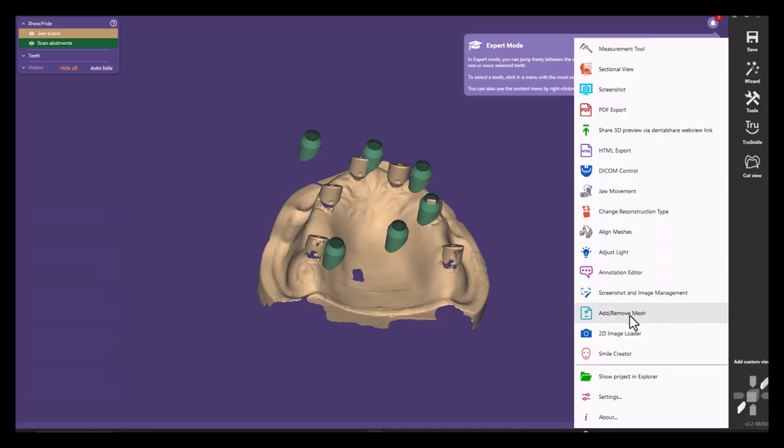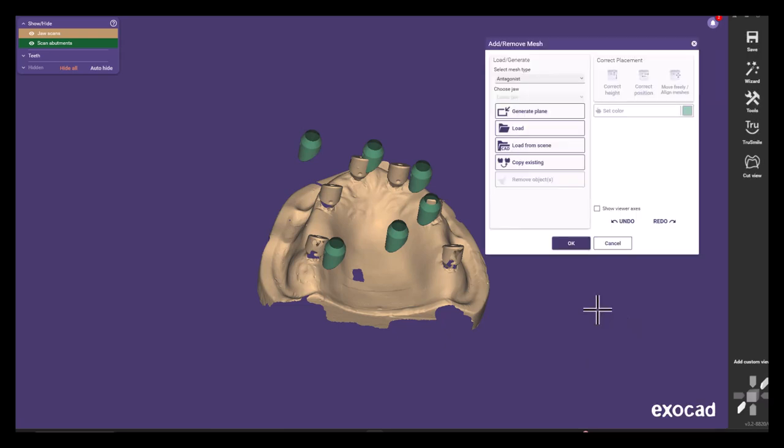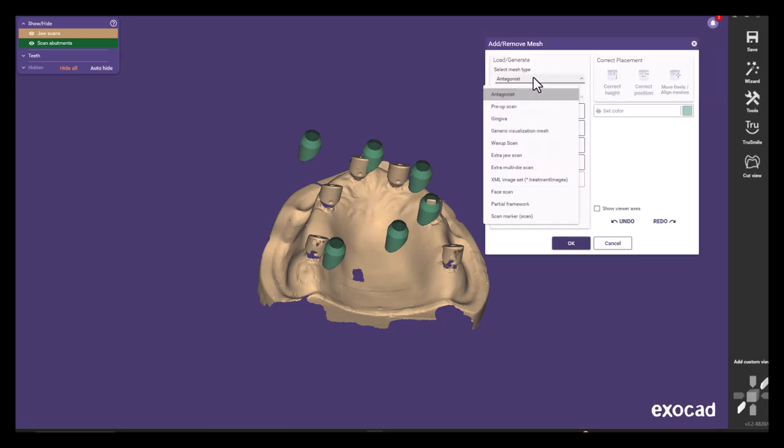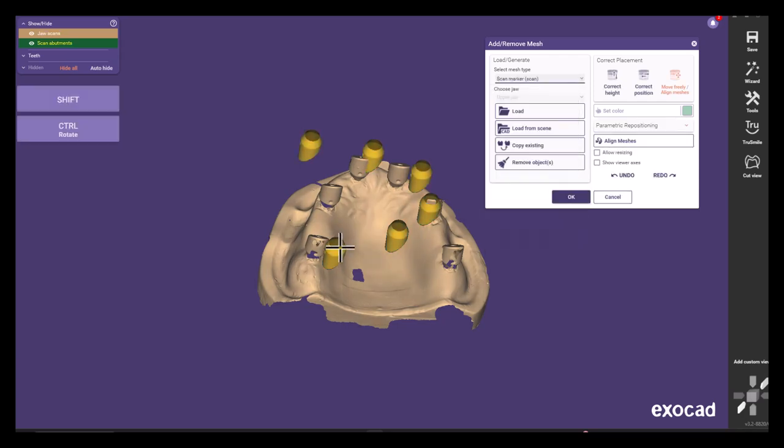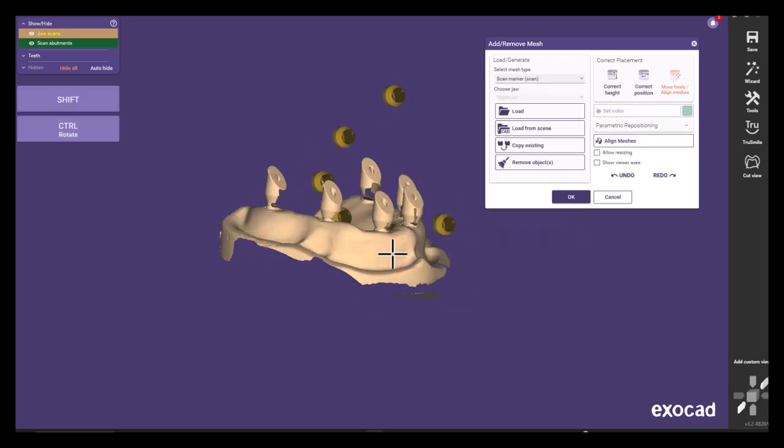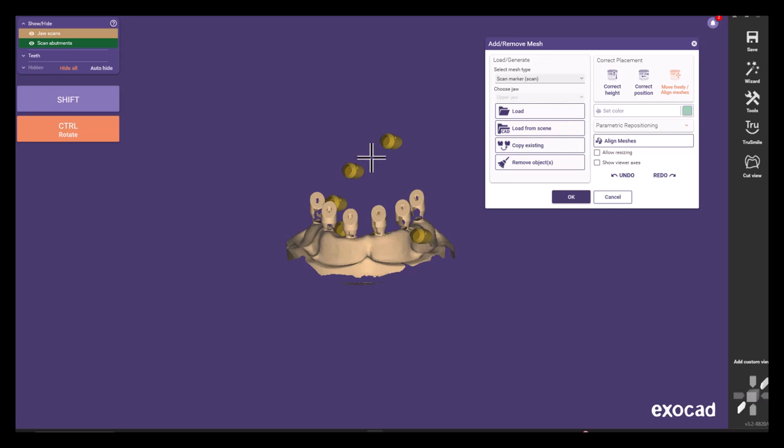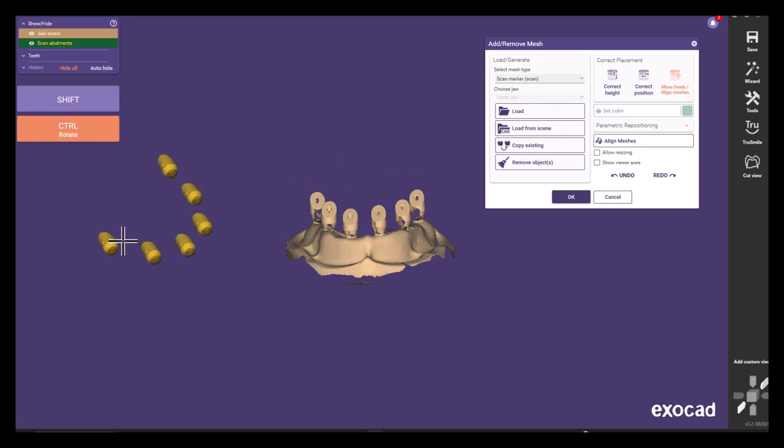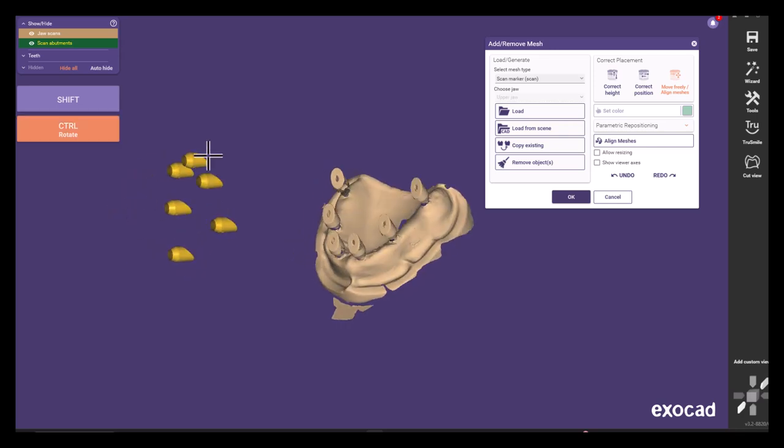In tools select add remove mesh and the mesh type that needs to be re-aligned is the scan marker scan. We then need to manually position both meshes such that it would be convenient to set a few corresponding points and it may be a little tricky at first sight.